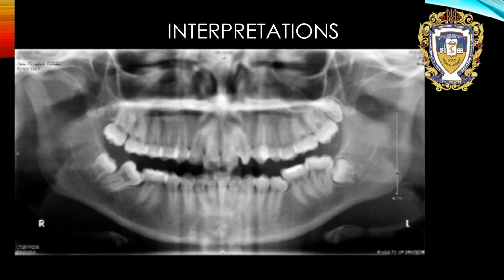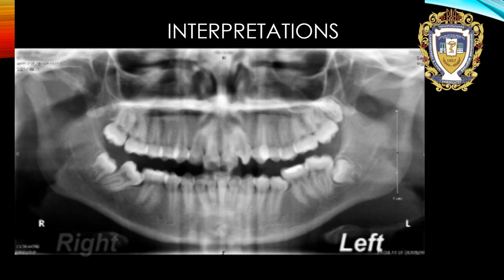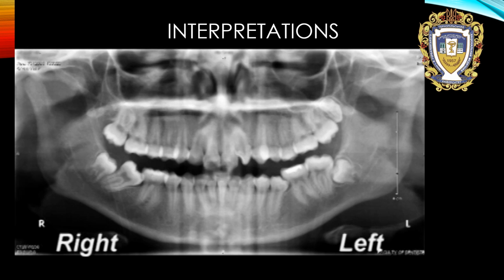Compared to a series of intraoral radiographs, the panoramic radiograph depicts a much larger area of anatomic structures of the oral and maxillofacial region. Therefore, much more time will be spent doing this part of the interpretation. It is critical to have a good understanding of the normal anatomy in order to identify the presence of any abnormalities. It is useful to compare the left and right sides of the image when deciding if a finding is normal, since structures appearing bilaterally are generally anatomic. Comparing the left and right sides should also be done in order to detect any asymmetries that may be indicative of pathology or a developmental condition.